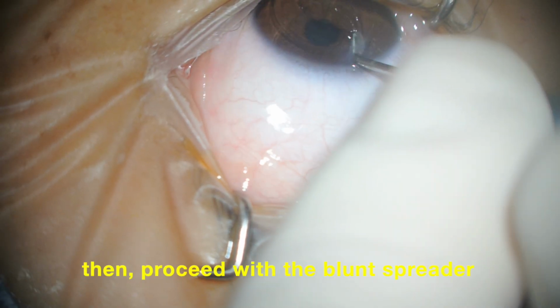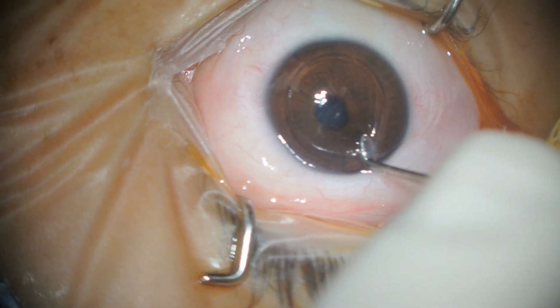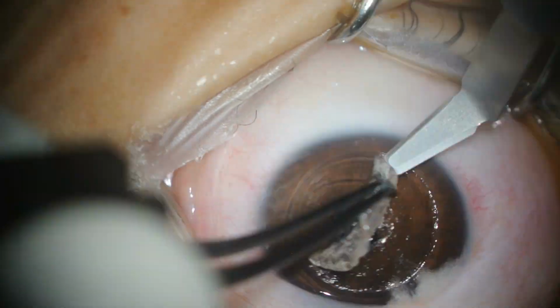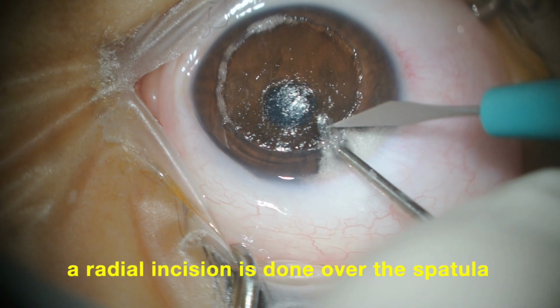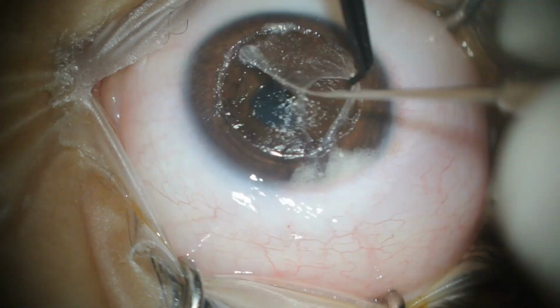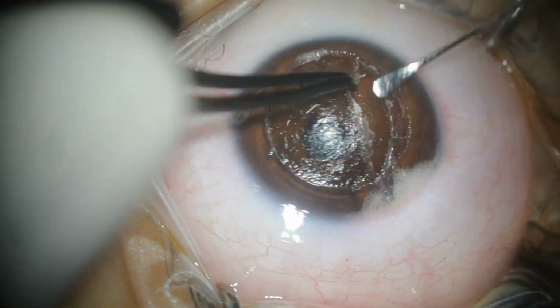Peripheral 90% depth incision. Then, proceed with the blunt spreader to make a deep pocket into the stroma. Debulking superficial stroma with a crescent blade. Using a blunt spatula into the pocket, a radial incision is done over the spatula, to avoid the contact of the blade with the deep stroma. Using a blunt spatula, proceed to 360 degrees deep dissection.